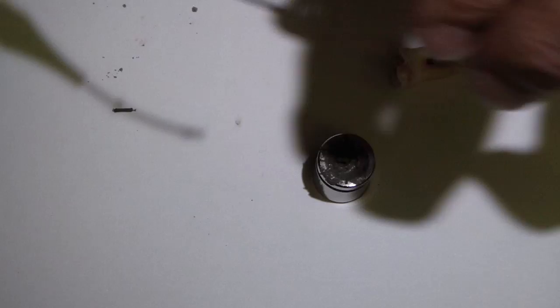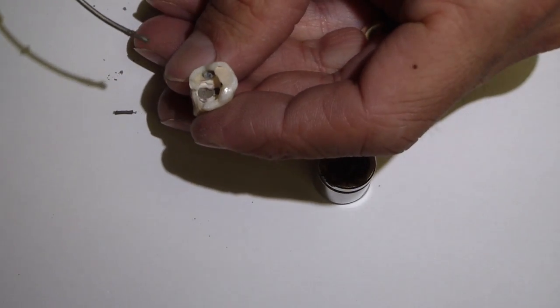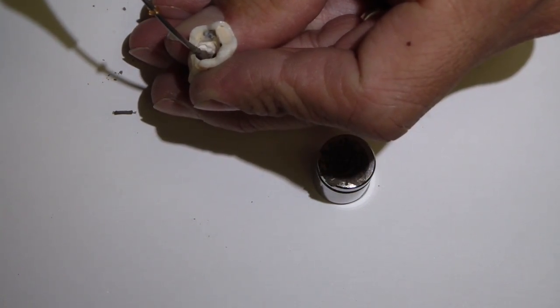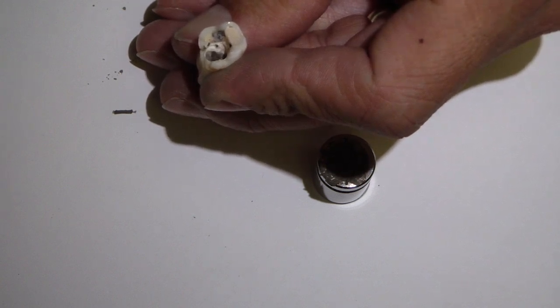Okay, remove the excess. And the best time to repair a perforation is at the moment you do it. Okay. Pull back on the piston.